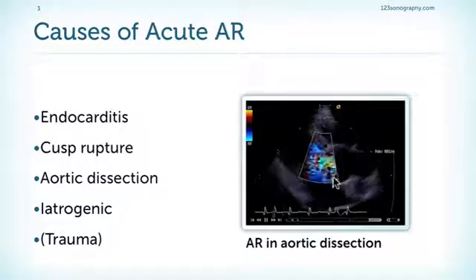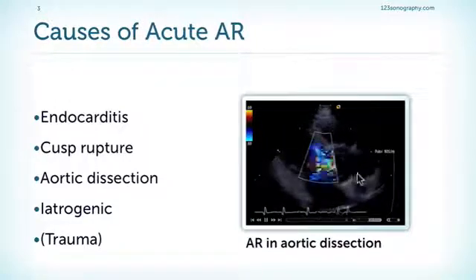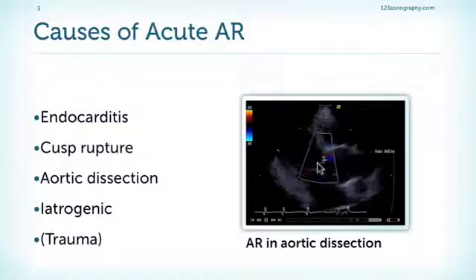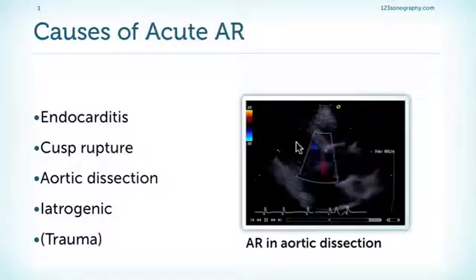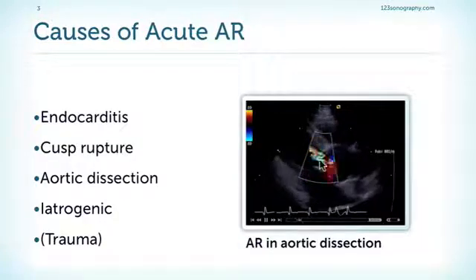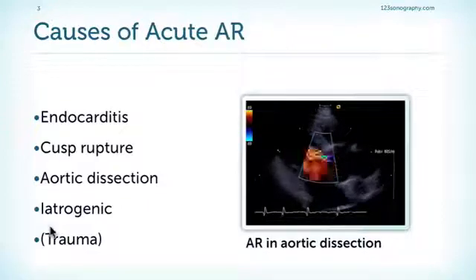We can see a dissection membrane here in the aortic root, and this dissection membrane causes a malfunction of the aorta and severe aortic regurgitation with a very broad jet and a very large flow-convergence zone.